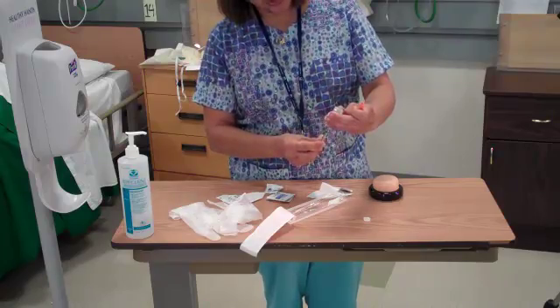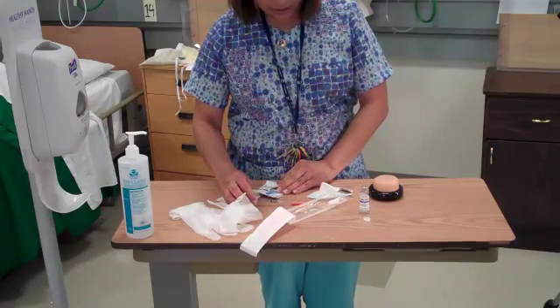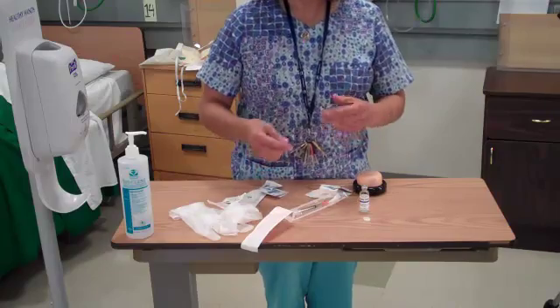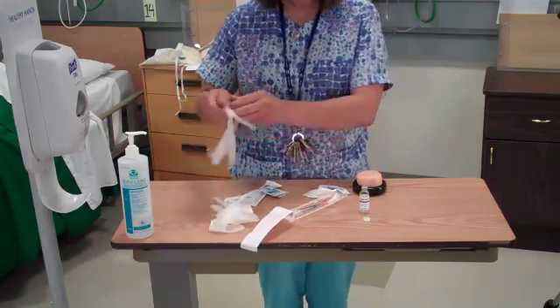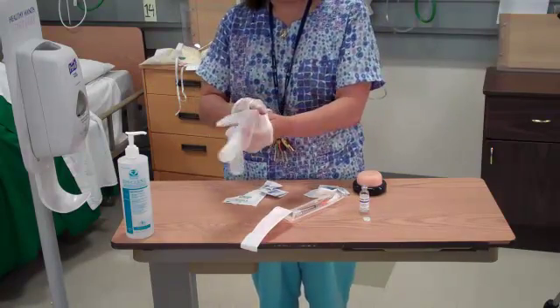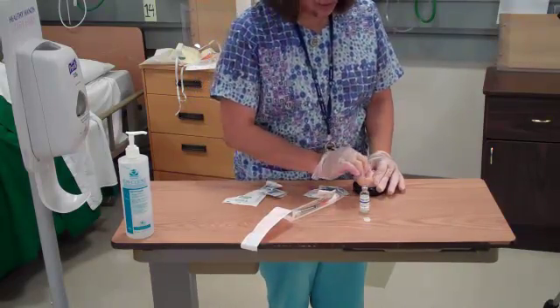Aspirate 20 units, then recap the syringe and place it in the tray. I'm going to go to my patient's bedside. I will cleanse the site. I'll go ahead and pinch the skin, cleanse the site with alcohol.